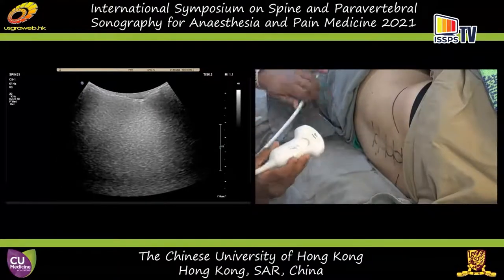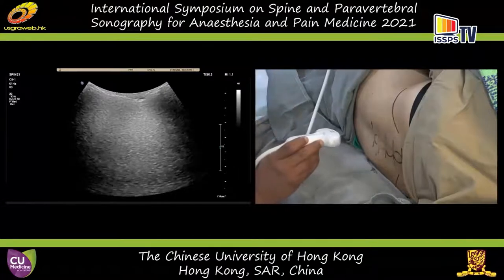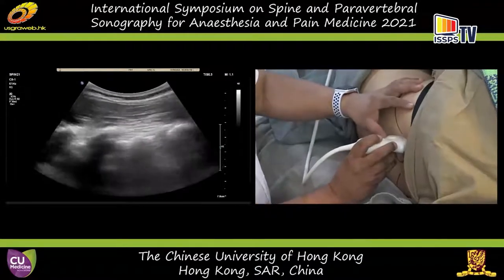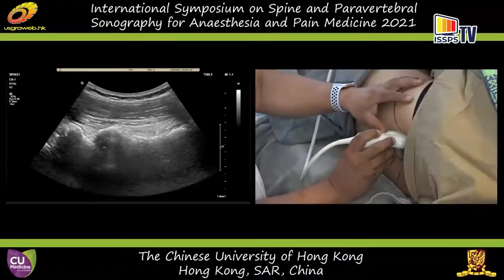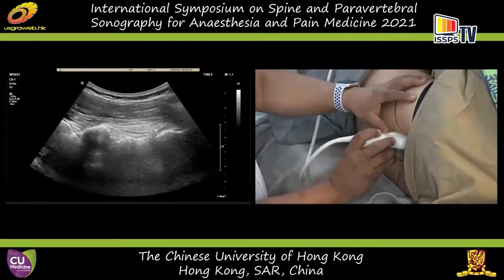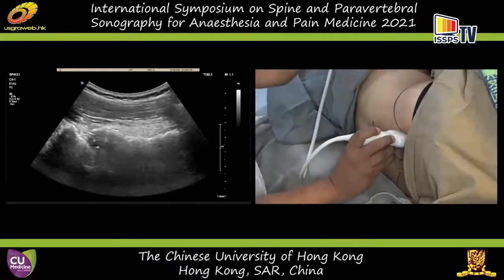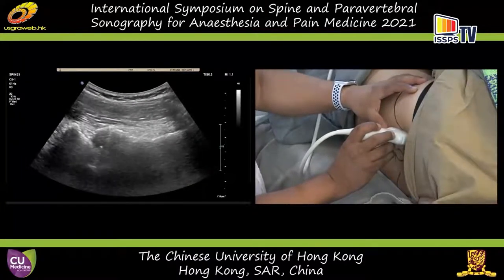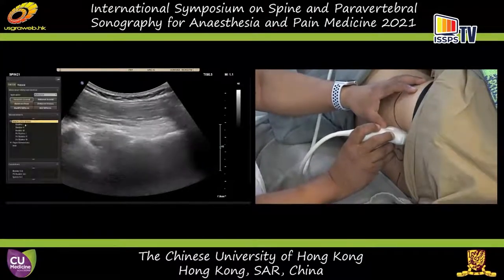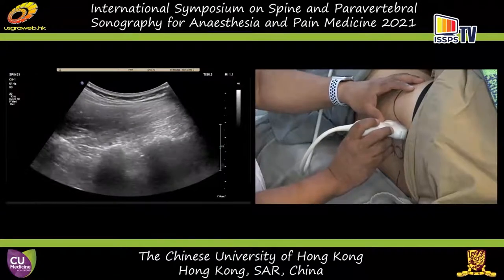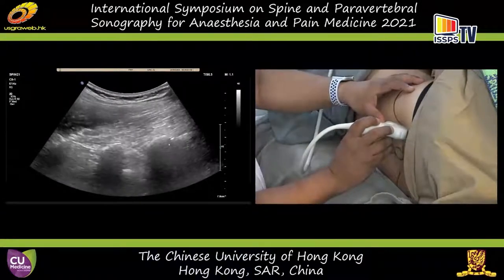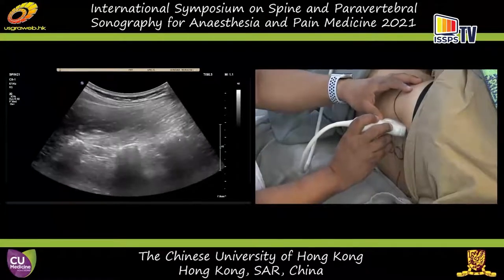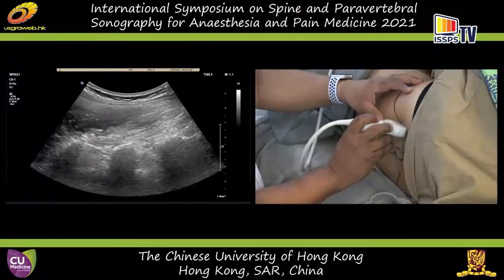In order to do a paramedian sagittal scan, we need to start from the sacrum. We start at the level of the sacrum. At the caudal end, you can see a large flat surface of the sacrum. As I move more cranially, that's the sacrum, and then you can see the first lamina of L5.